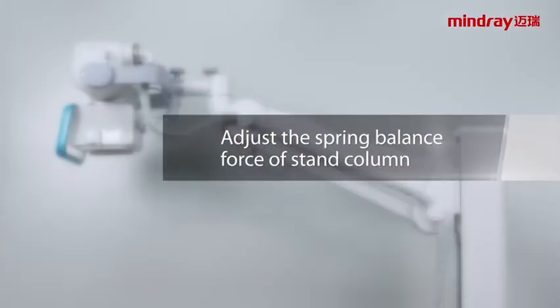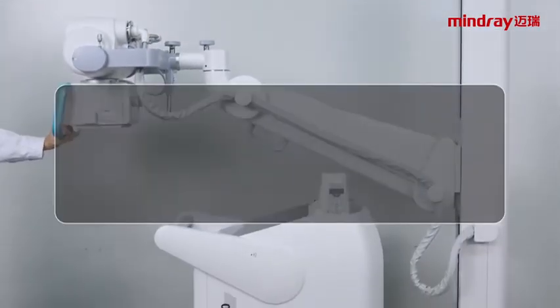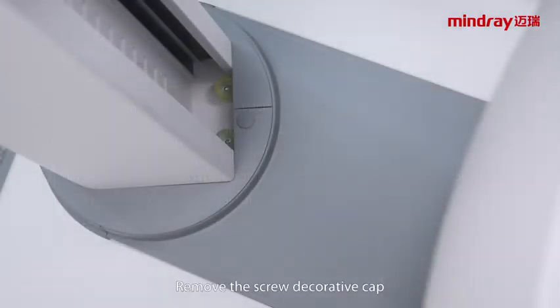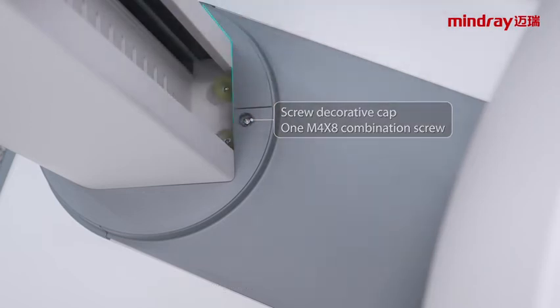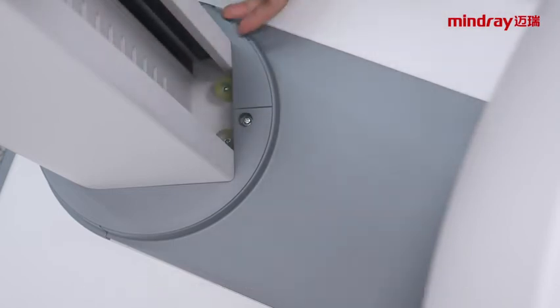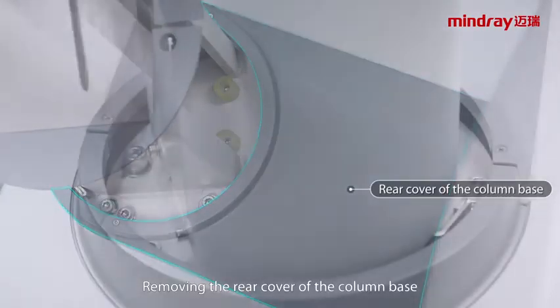Adjusting the spring balance force of the stand column. When a machine is used for a period of time, the tube assembly may become unbalanced — for example, the tube assembly would drop automatically after unlocking. In this case, it is necessary to adjust the spring balance force in the column. The maintenance steps are as follows: remove the screw decorative cap, then remove the lower cover of the column with a cross screwdriver. Remove the rear cover of the column base.